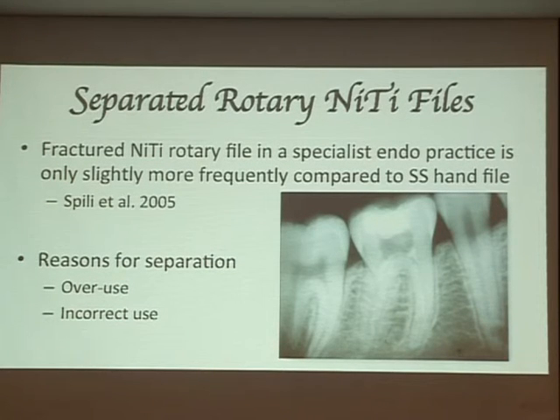There was a study that found that separated nickel titanium instruments are very similar to hand files, which means, in fact, you separate your hand files, but you just do not know that. I can advise you to go back and check your files in the office. Most people will reuse their files, right? You are not single use. Are any of you using single-use hand files?